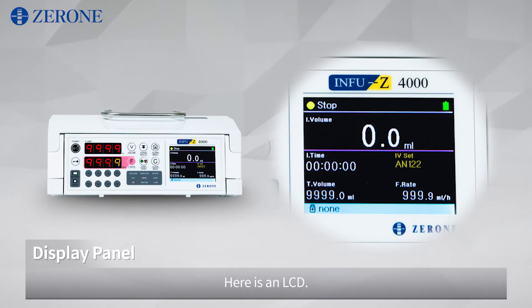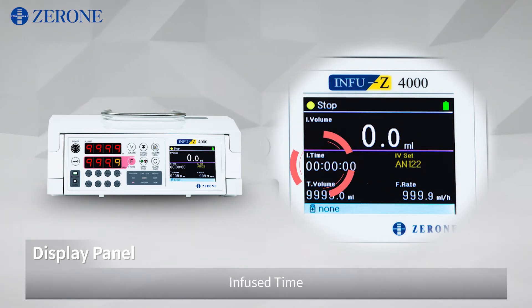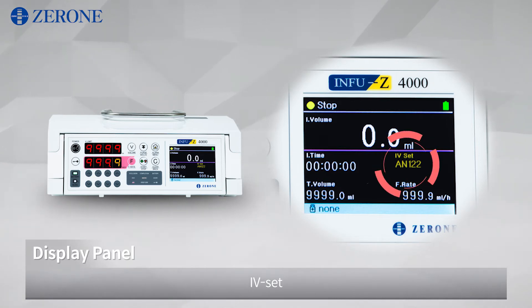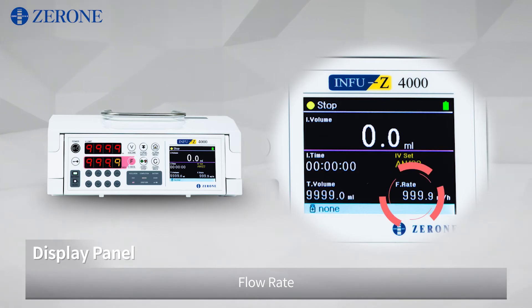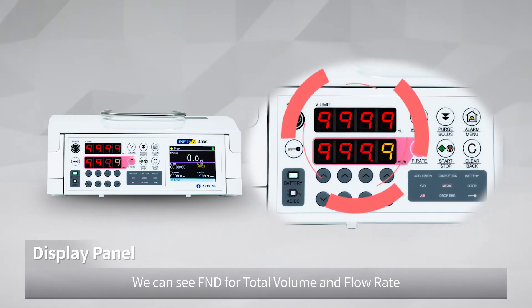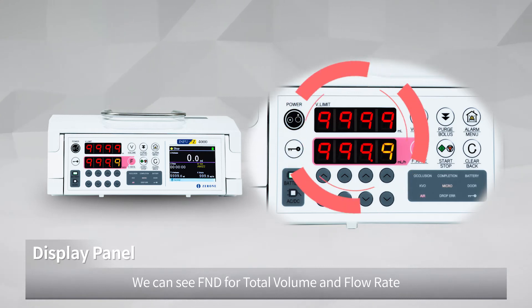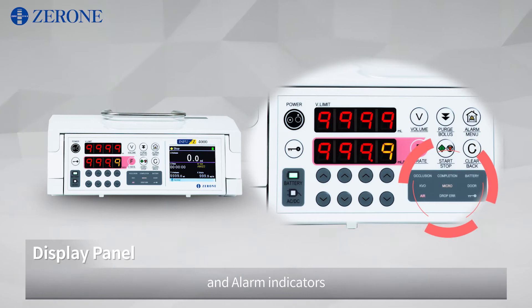Here is an LCD. It shows status, infused volume, infused time, IV set, total volume, flow rate, and drug. We can see FND for total volume and flow rate. There are LED indicators for the battery and AC/DC, and alarm indicators.